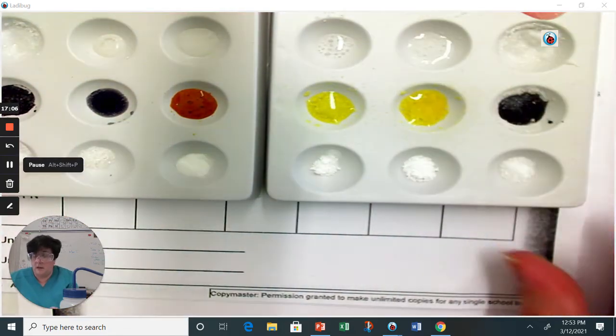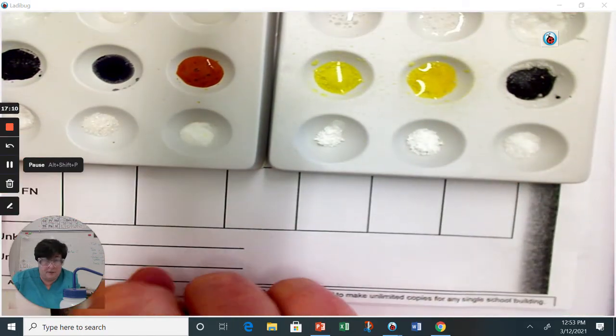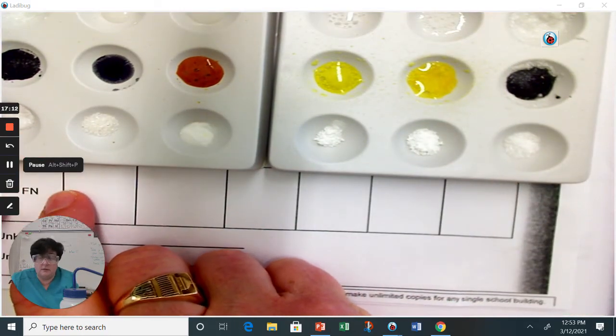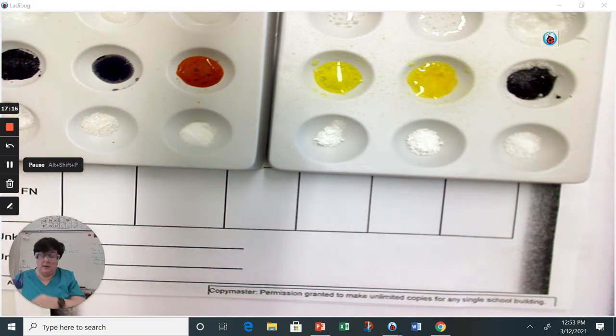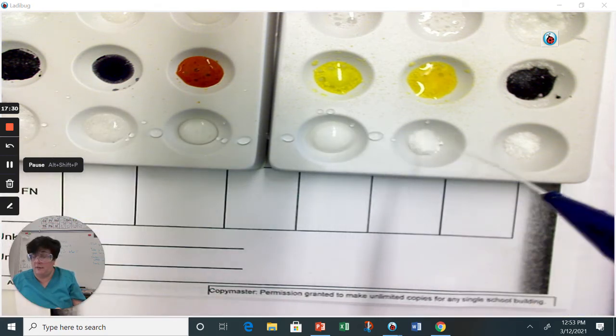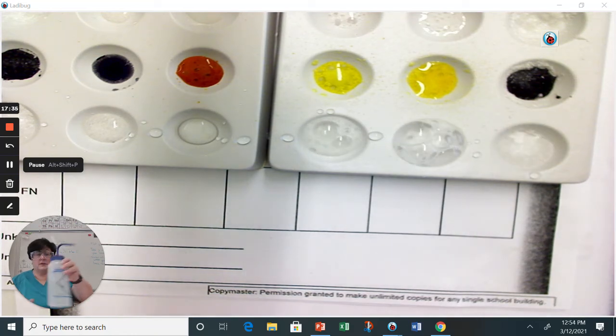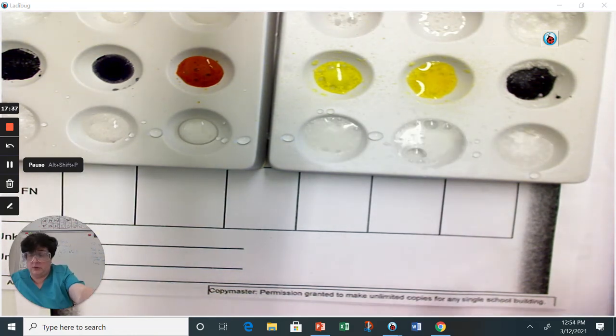Okay. Now I'm just going to go back and put a little bit of water, just a tiny bit, in each well, not a lot, and I can get my water going at a steady stream here. It's really hard when you're up above, but this is how you should add it. You should never have the tip of your water bottle in the material. The reason I'm adding some extra water, guys, is that I'm not going to stir it with a toothpick.